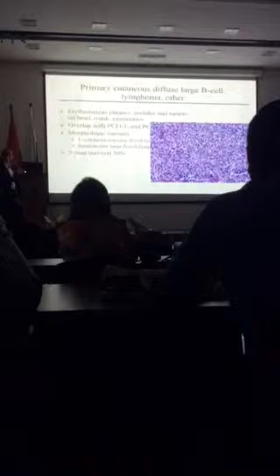This is actually just a close-up. You can see these large centroblasts, and some of them immunoblasts maybe. So 5-year survival is 50%. So there's not much done in terms of molecular testing.